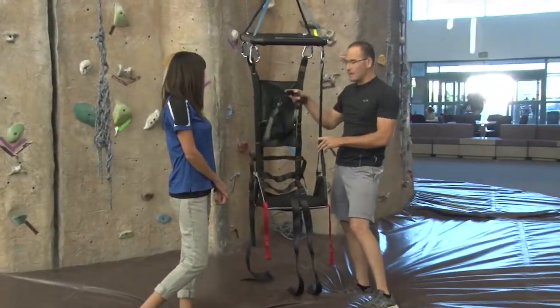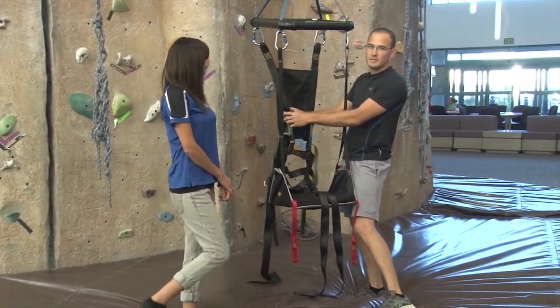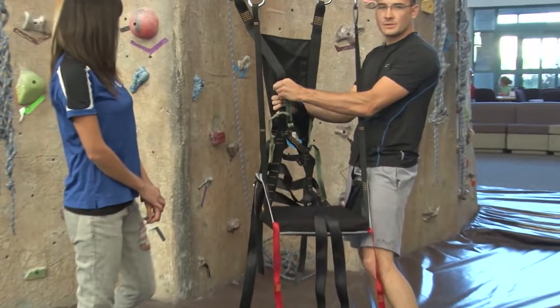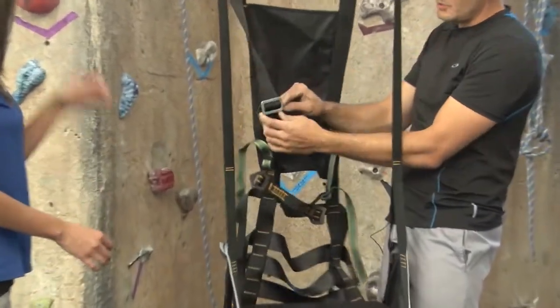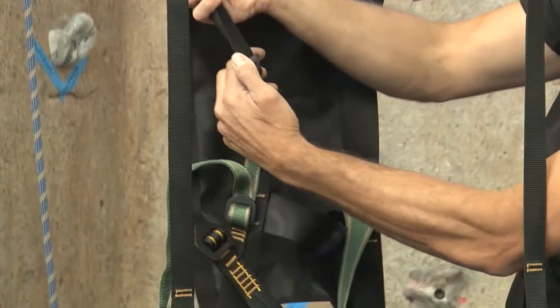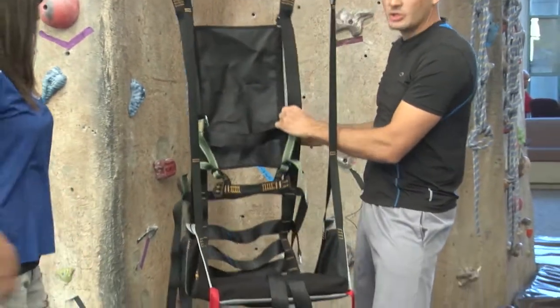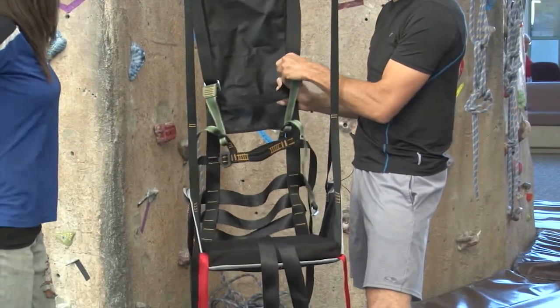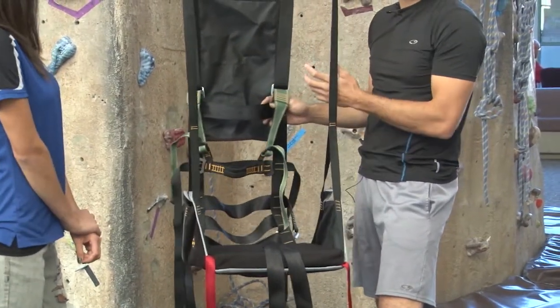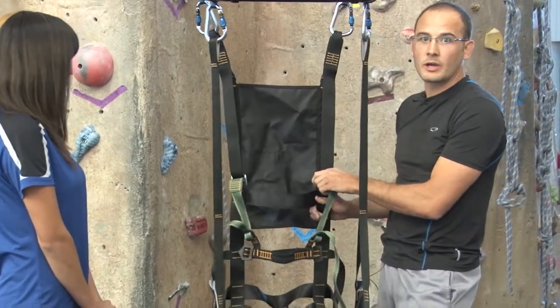Notice that the chair has a couple of different straps that we can adjust. We have the shoulder straps that can be adjusted by the quick buckles on the back — just slide upward or downward to adjust. You can do both or one on either side. If we have problems with one side being higher than the other, we can adjust the shoulder strap accordingly.